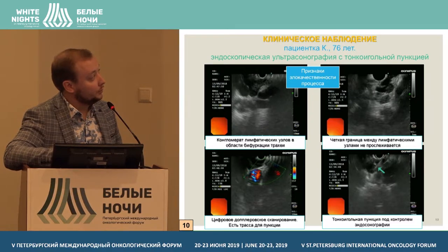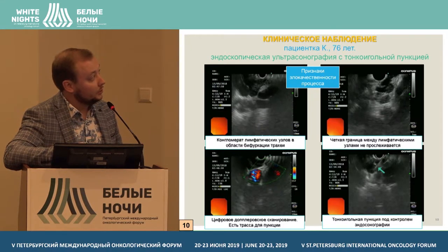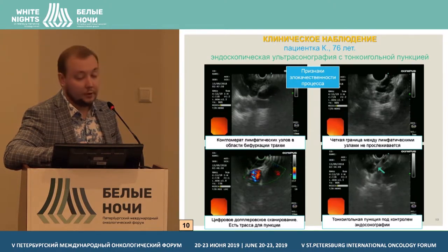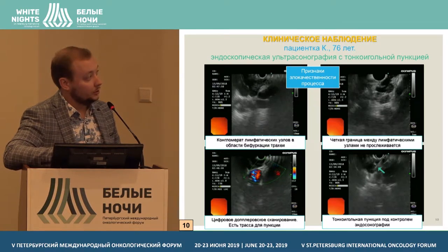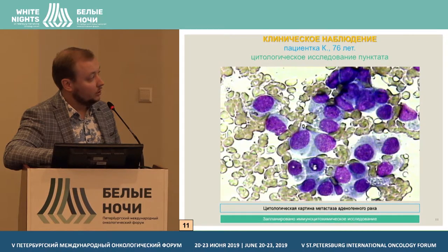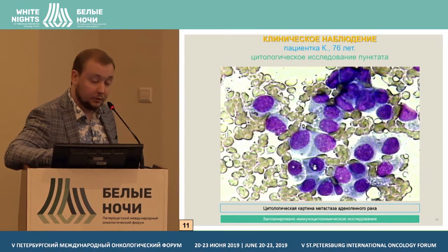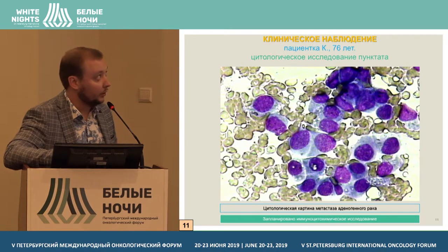This is the endoscopic sonography view showing a conglomerate of lymph nodes in the area of bifurcation with signs of malignancy. Here is the puncture being performed, and we received a cytological picture confirming metastasis.